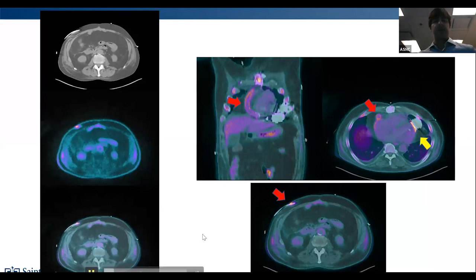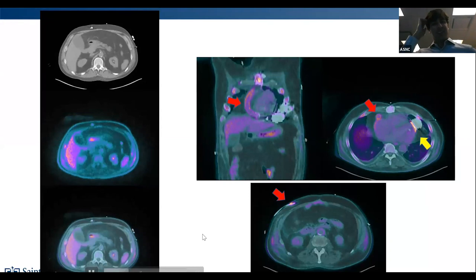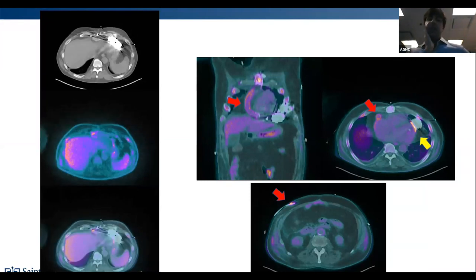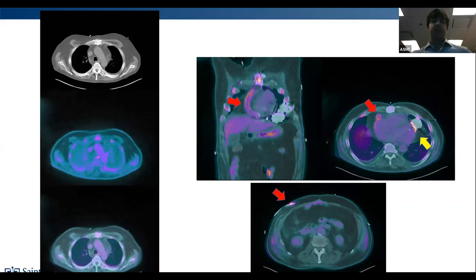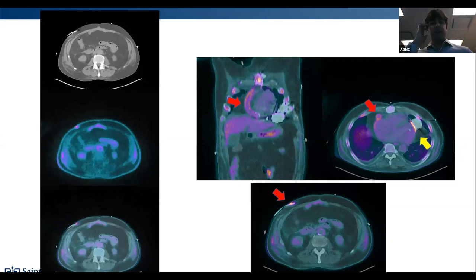There we go. This is playing through again. You sometimes see that. It could be early after LVAD, there can be some inflammation there as things are healing, usually for 6 to 8 weeks, as the drive line exit site is healing and really gets anchored into the skin. But after that, you should not have a lot of uptake in that area. So there could be a little issue there. But this does not track all the way into the body.